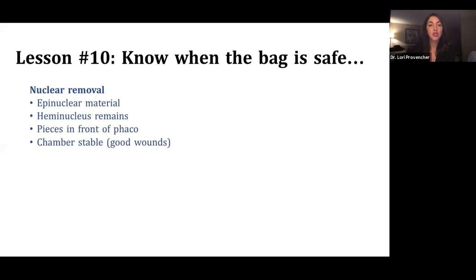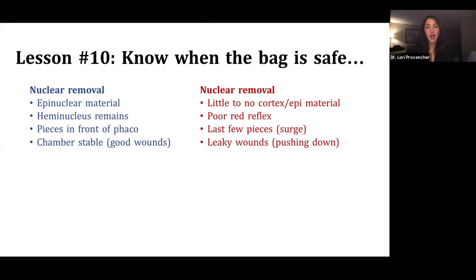So during nuclear removal, if there's a lot of epinuclear material, you're safer. The bag is pushed back, and it's out of the way of the phaco needle. Similarly, when there's a hemi-nucleus still in the bag, the bag is kept back well, generally. Or when there are nuclear pieces in front of your phaco tip, that usually protects the bag from coming up to the phaco needle. Also, if you have a stable chamber, you're going to be safer. The converse to that is you're less safe and the bag is more at risk when there's little or no cortical or epinuclear material.